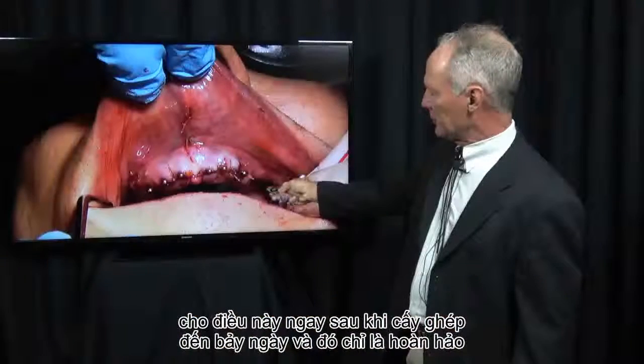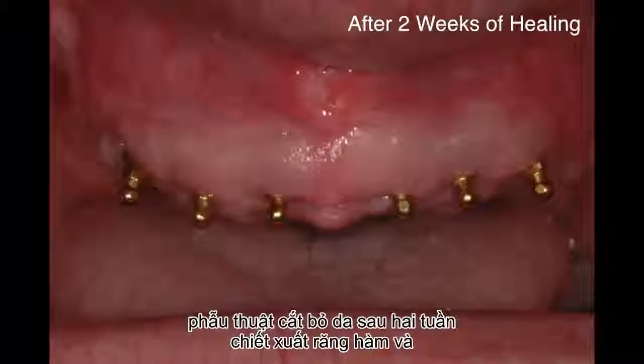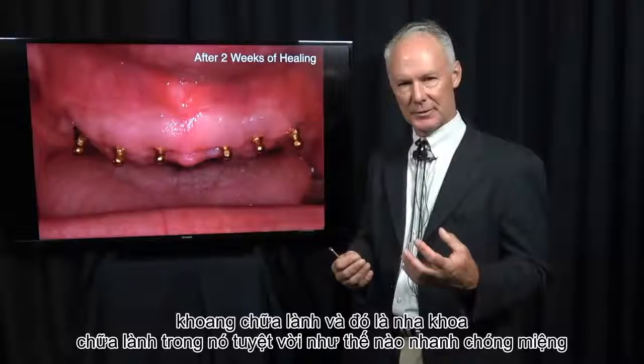This is immediately after implant placement, teeth extraction, and frenectomy. This is after two weeks of healing. Isn't it amazing how fast the oral cavity heals?